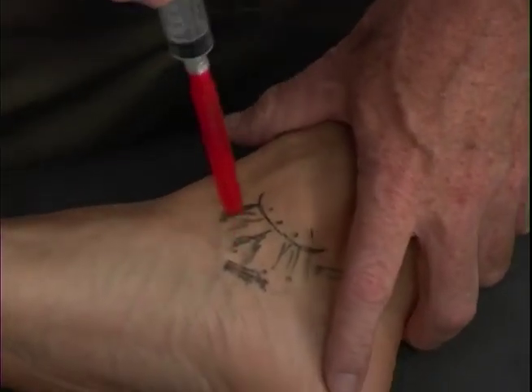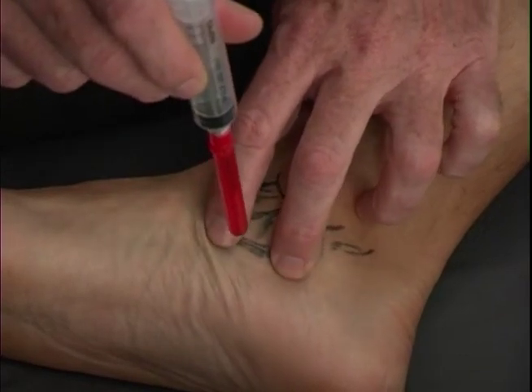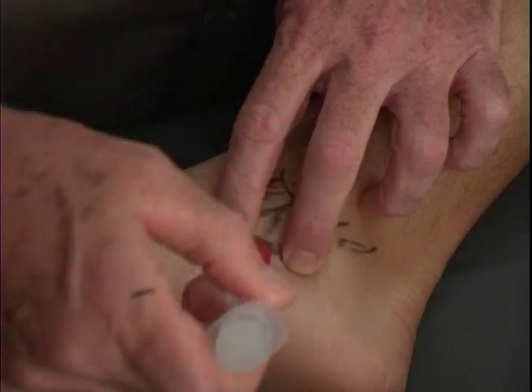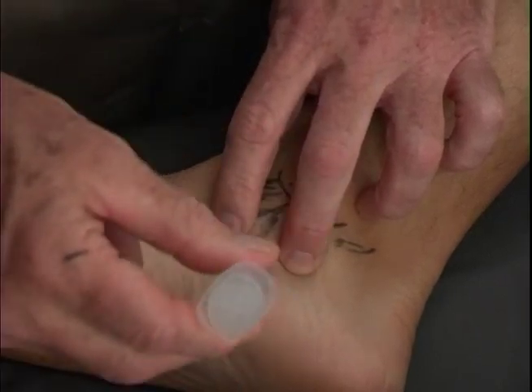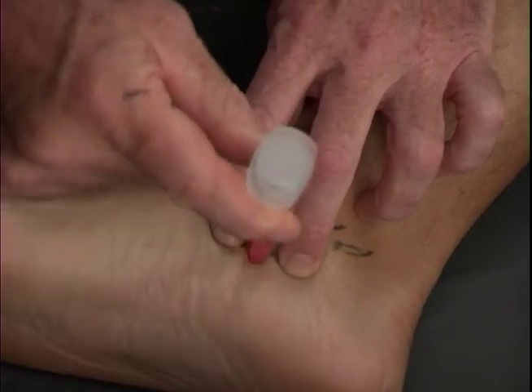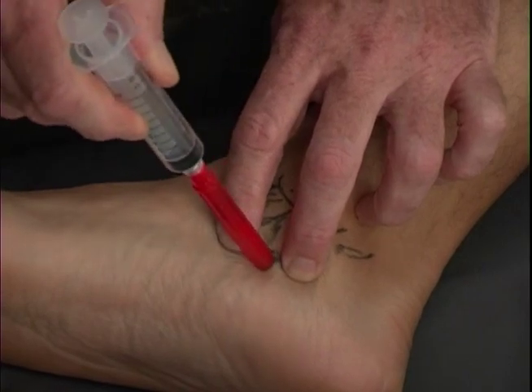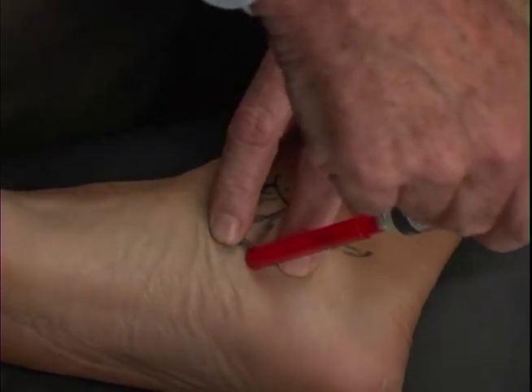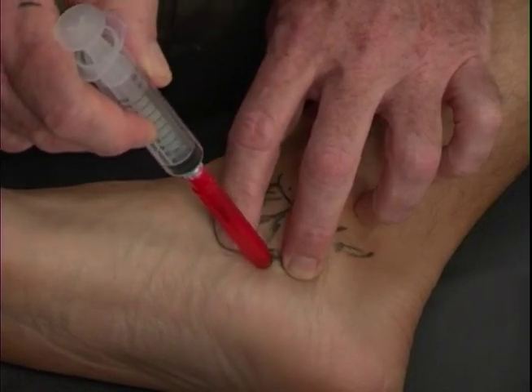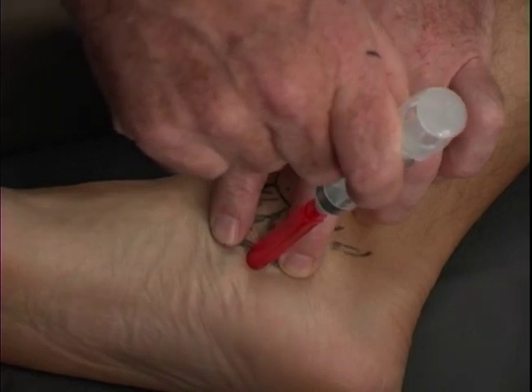So with our injection in the foot itself, we're coming between those two prominences, and you can place your fingers on them. And with our needle aimed a little bit in the dorsal direction rather than the plantar direction, we come across the foot and hit the bone, and then redirect our needle going backwards and forwards to hit the other areas of the calcaneal navicular ligament and the cuboid navicular ligament in this area.